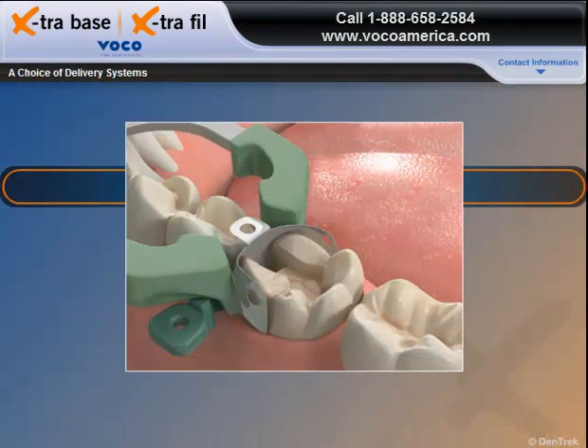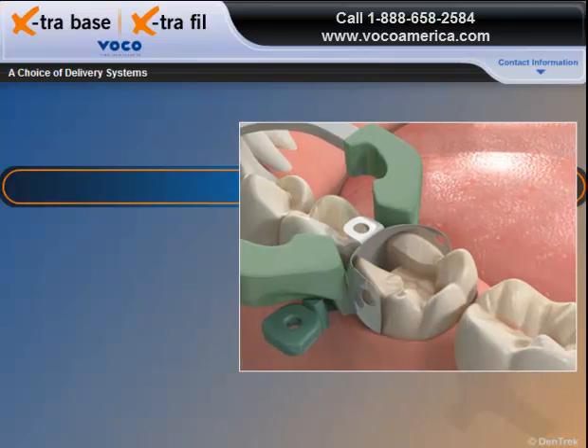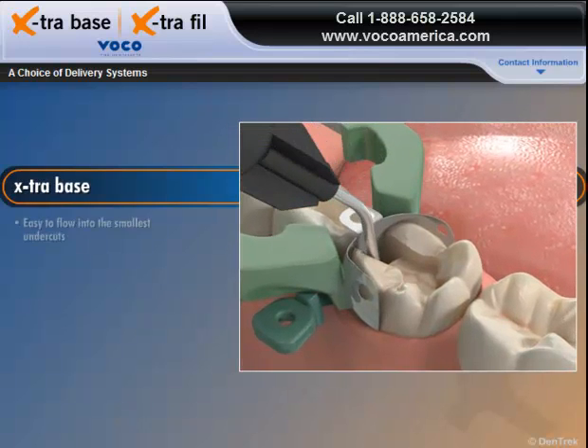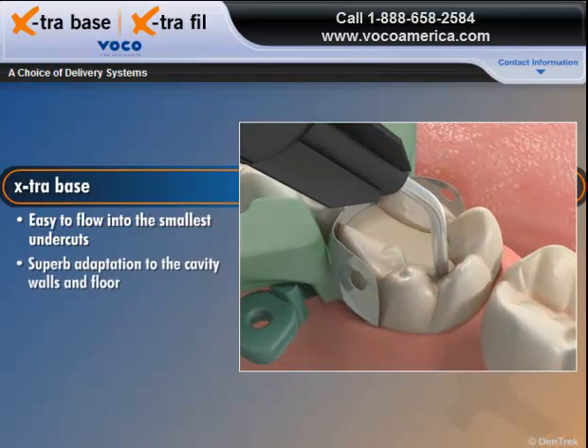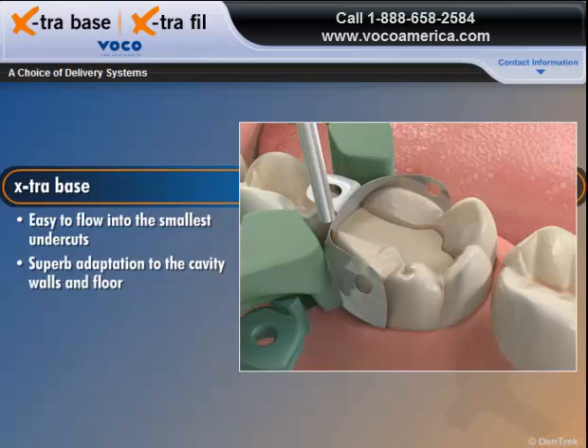Working with posterior restorations often involves proximally deep and narrow cavities that are difficult to reach. The flowable consistency of Extra Base makes it easy for the material to flow into the smallest undercuts, enabling superb adaptation to the cavity walls and floor.